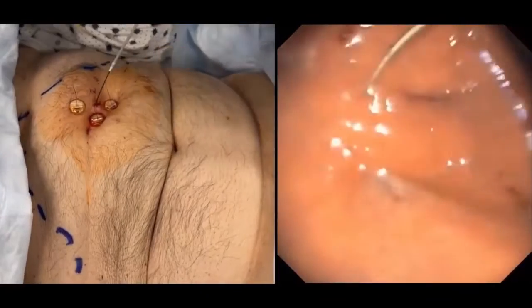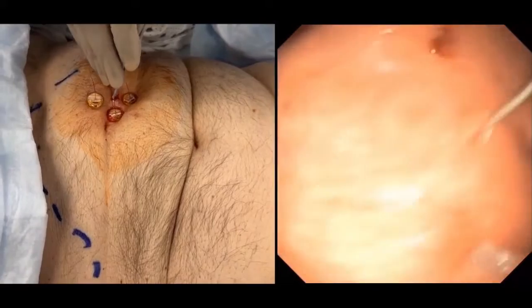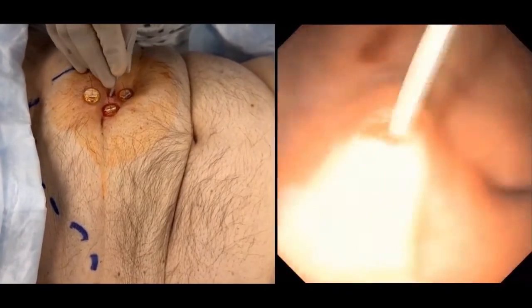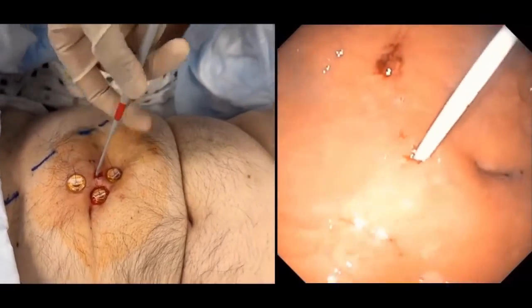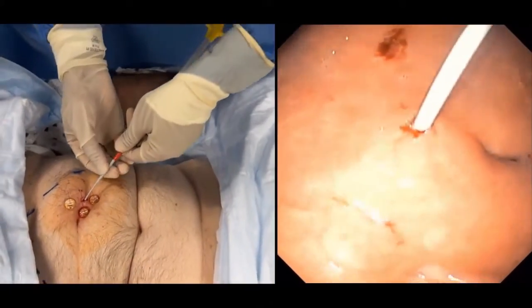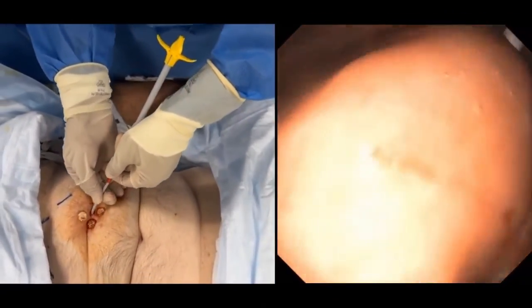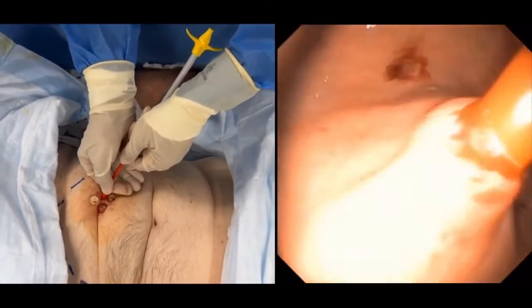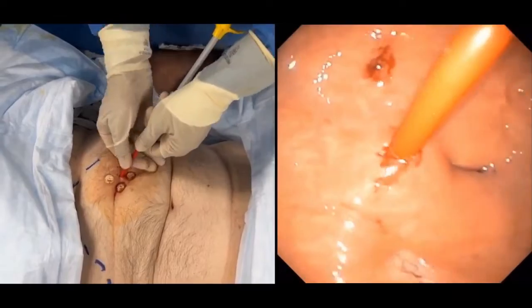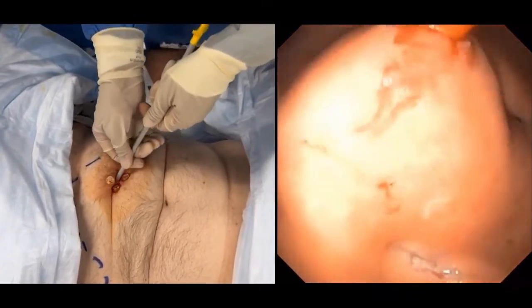Back to the patient, we start by inserting the thinnest dilator and then moving to the next and then the next until we complete inserting all five dilators. The third and middle dilator measures 14 French in diameter and is always red in color.